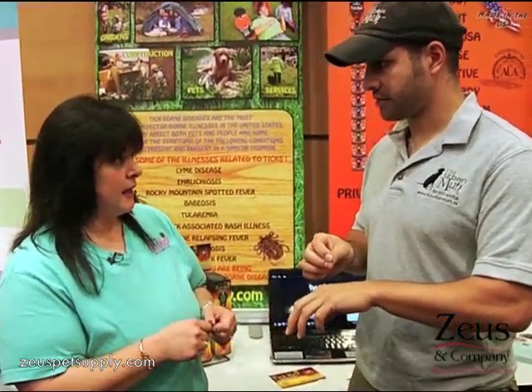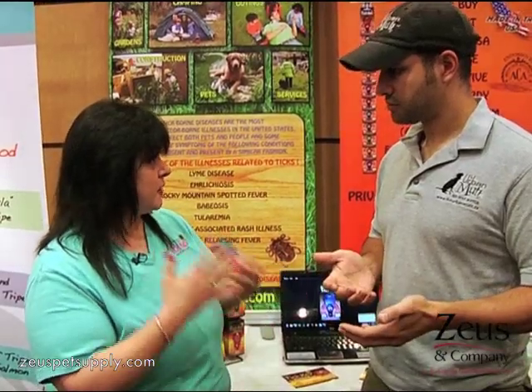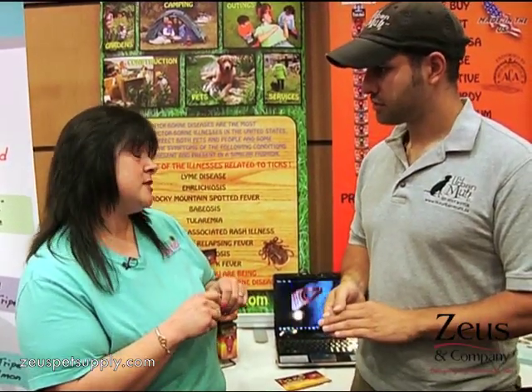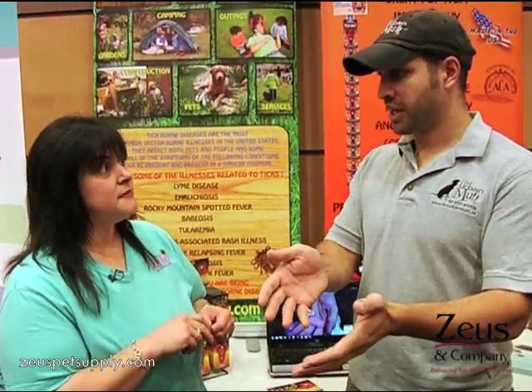This is better than using tweezers or any other kind of stuff, right? Absolutely, because when you traumatize a tick by pulling and pinching and trying to get to them, what will happen is the tick will get traumatized, and once he's traumatized, he'll start to regurgitate all of his stomach contents. So if he bit any other animals or anything like that, if there's any kind of pathogens or anything inside of his stomach, he regurgitates that back into you.